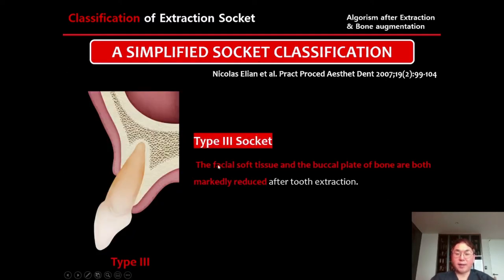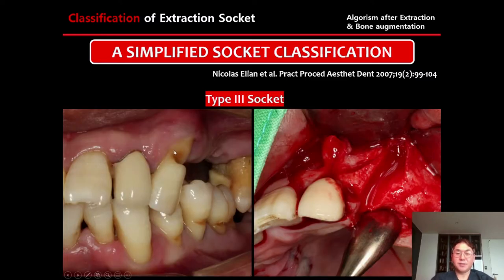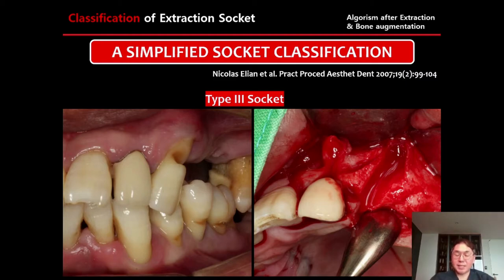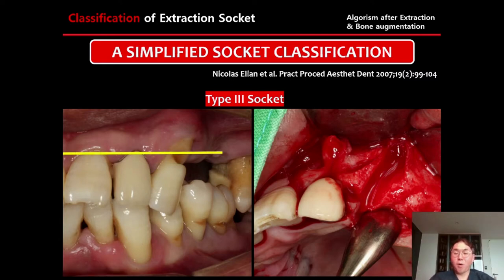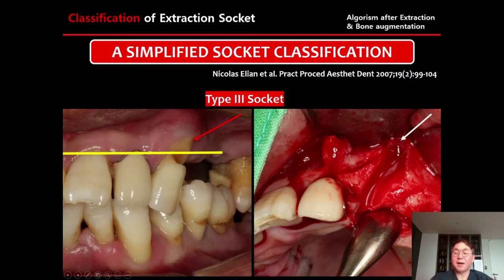Type 3 socket: both soft tissue and buccal plate of bone are markedly reduced. Here is a Type 3 extraction socket — after canine extraction, we will have a Type 3 socket due to a pre-existing buccal bone defect and buccal gingival recession. The soft tissue always follows the underlying bone, so soft tissue recession means bone recession. After flap elevation, I confirmed severe labial bone recession — very easy to identify.